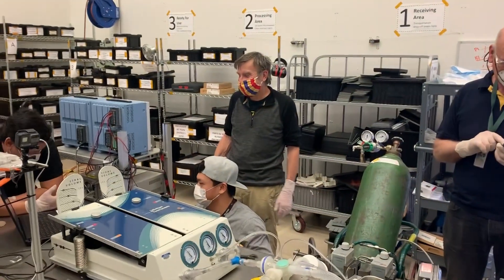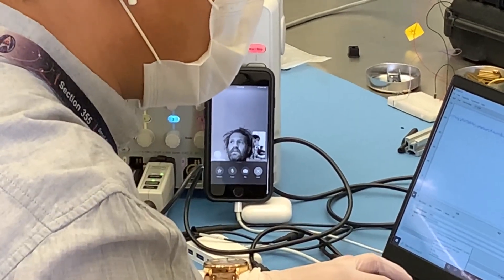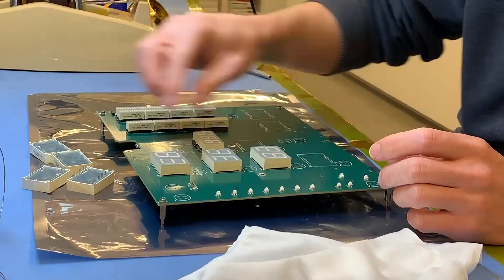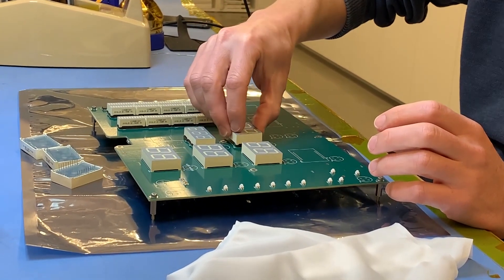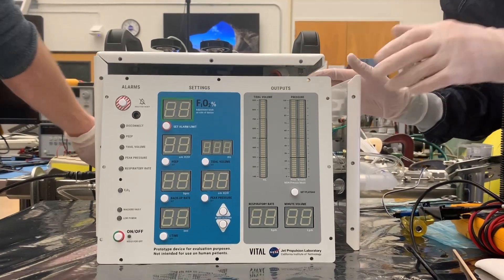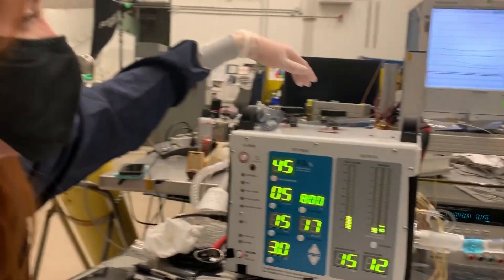Congratulations. All right, you can get pressure up. Still 800 milliliters, right? Yeah, it's just your eye time is still warming up.